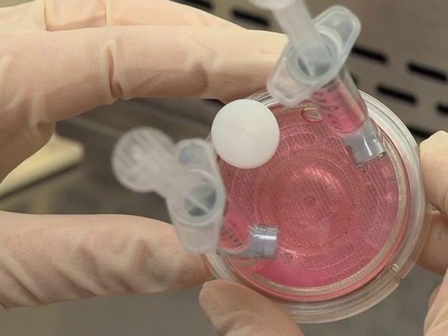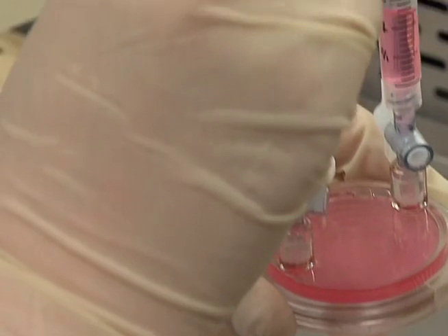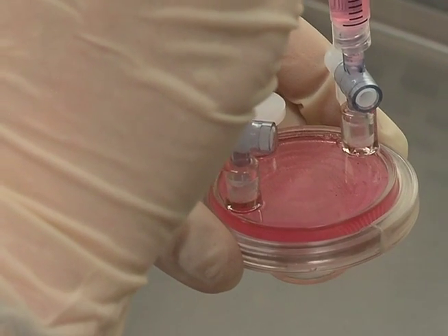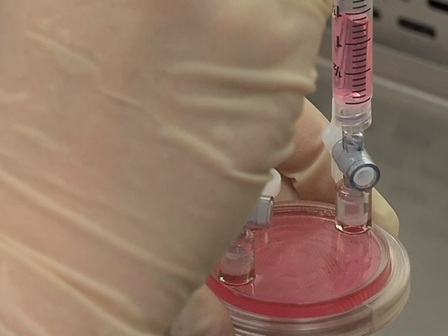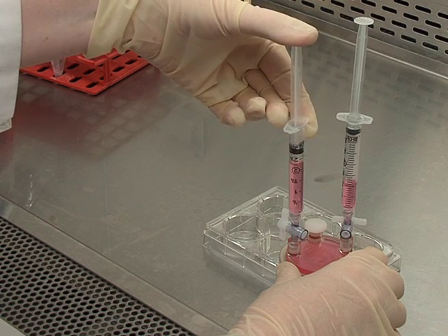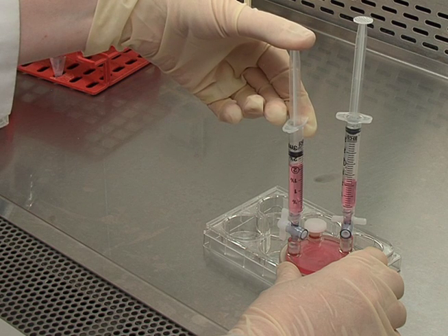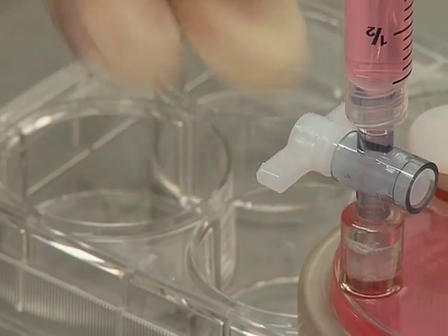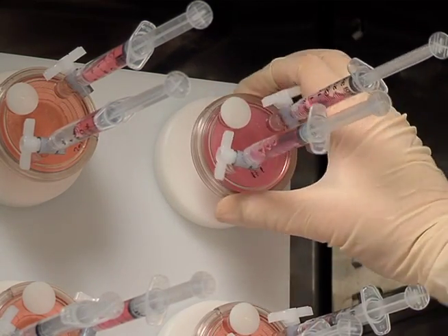Remove remaining bubbles by rotating the RCCS until the bubbles are under the small port. Then gently push down on the syringe on the opposite side to force the bubbles into the port and out of the chamber. Continue to close one side port, then gently push down on the other syringe piston to introduce a small amount of positive pressure into the vessel and close the second valve while applying pressure. Finally, load the RCCS onto the rotor.